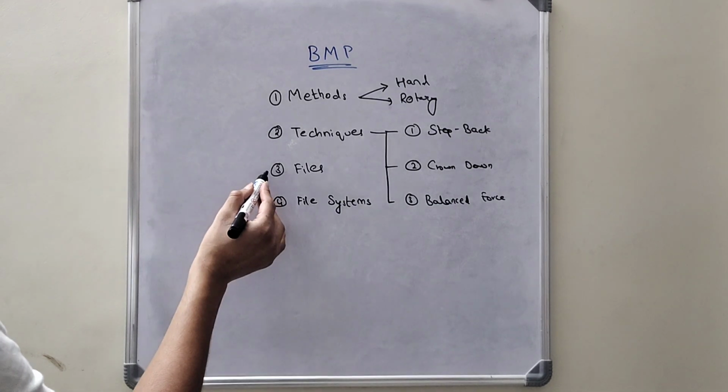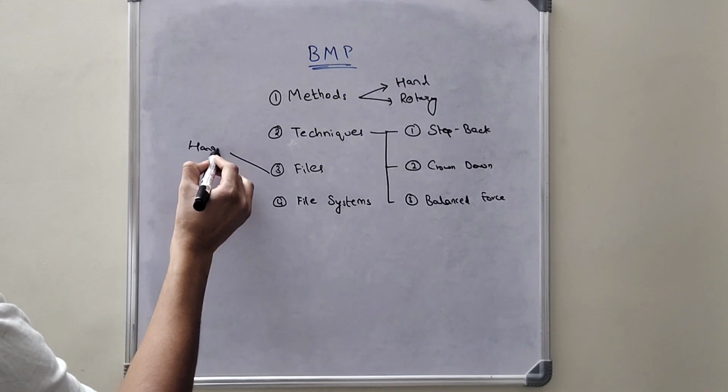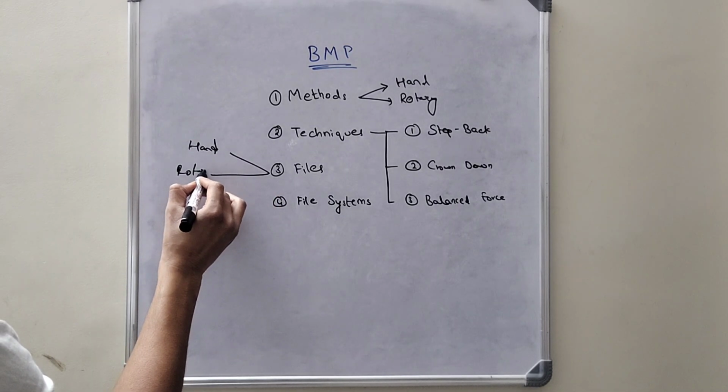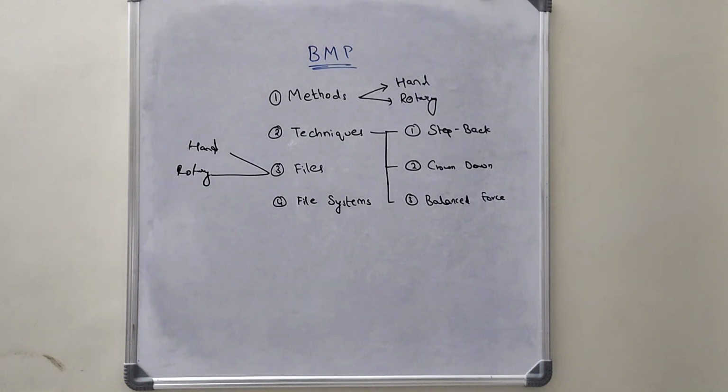And coming to the files, they are again hand files and rotary files. And file systems again is a completely different topic which will be discussed in the later videos.